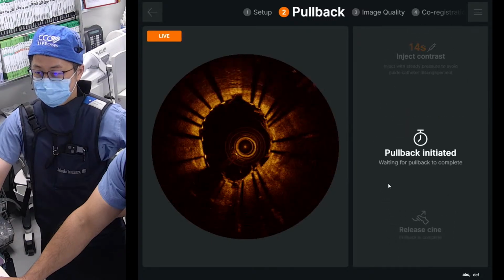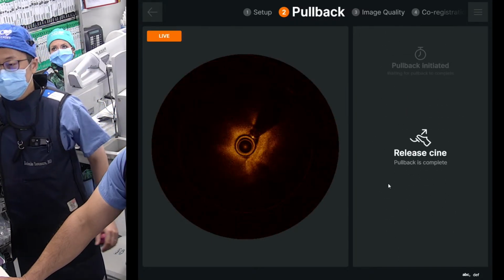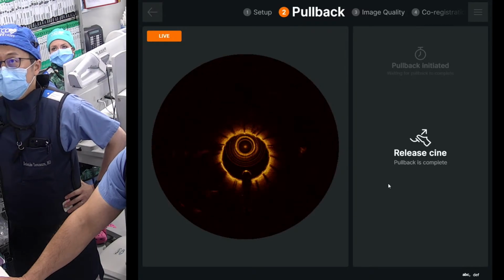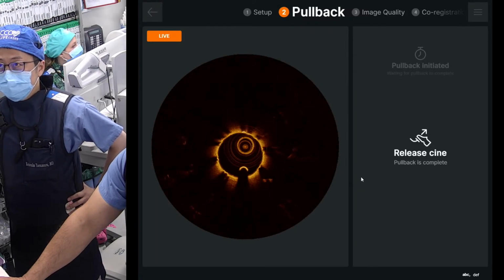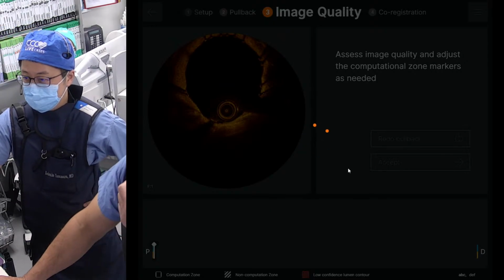We don't have this cine, but that's a good image. Why did we miss the cine? We did, but it's okay. We saw the OCT, which was wonderful. We could see that there was great clearance. You saw inside. You don't need to look outside.